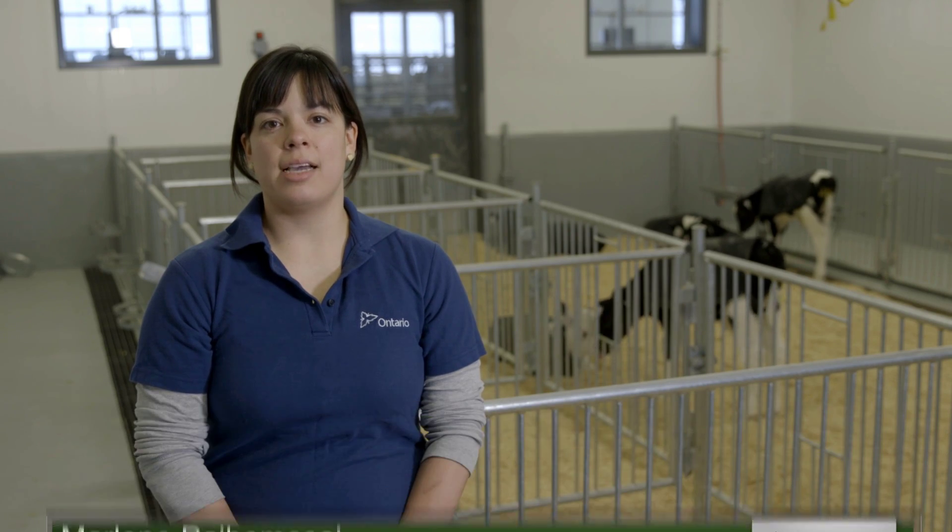Hi, I'm Marlene Pavamase, Dairy Specialist with the Ontario government. In this video I'll show you how to test colostrum quality.